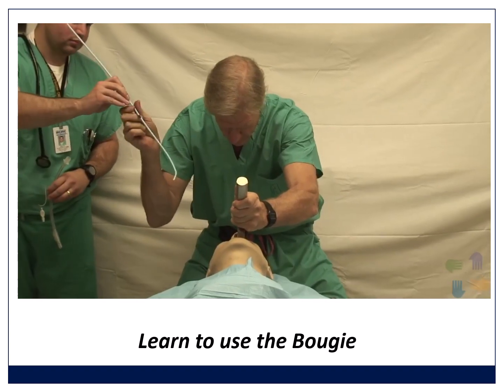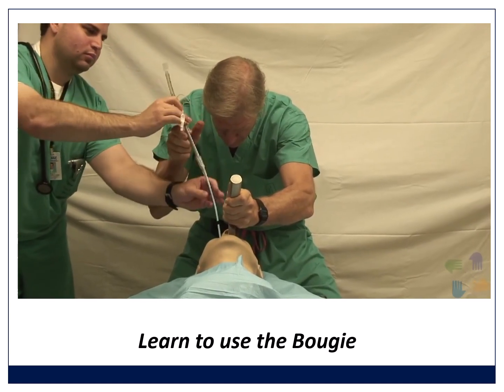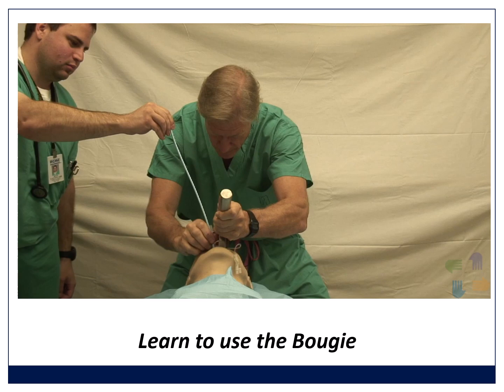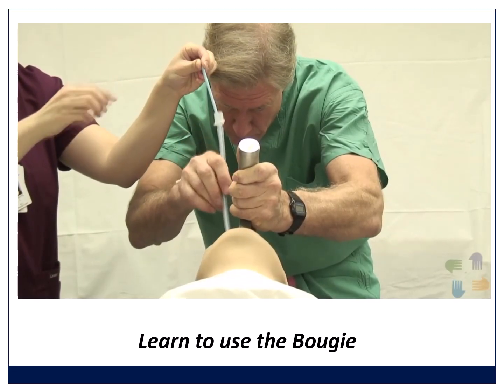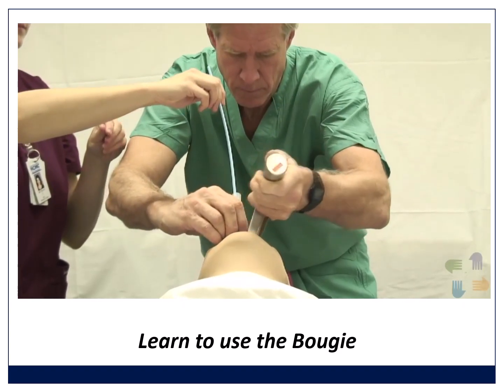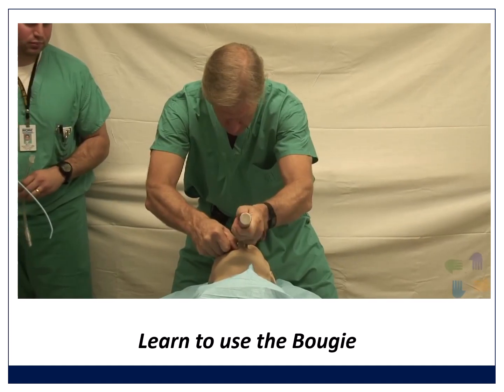Also to show you something else, watch as he's putting the bougie in. That left hand never comes off the laryngoscope. So the bougie goes in, the assistant loads, the left hand hasn't moved. The right hand grabs the tube, pushes it and corkscrews it, and then the assistant will pull out the bougie. And just to show you that corkscrew maneuver again, grabs it, twists it anti-clockwise. That's going to help it just ramp over the arytenoid cartilages. Assistant removes the bougie and he's holding onto that tube. That's a lovely technique and one worth learning.